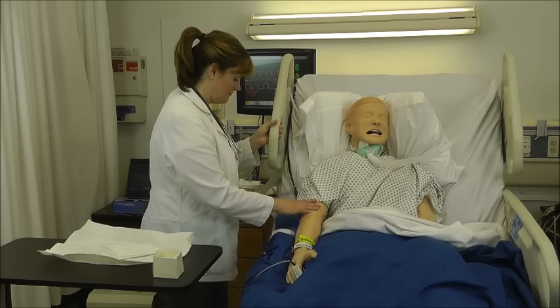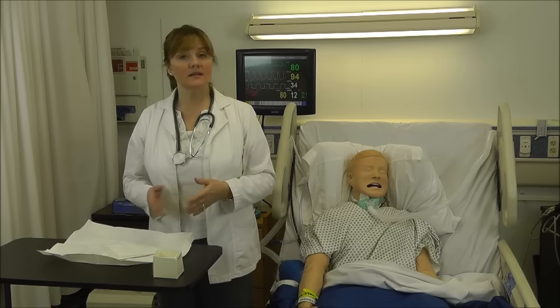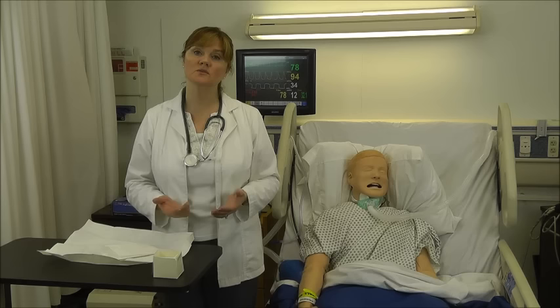and I'll lower the bed to its lowest position. I'll clean up my supplies and wash my hands. My last step will be to document the procedure. That includes how the patient tolerated it, what you noted about the secretions, and your respiratory assessment.